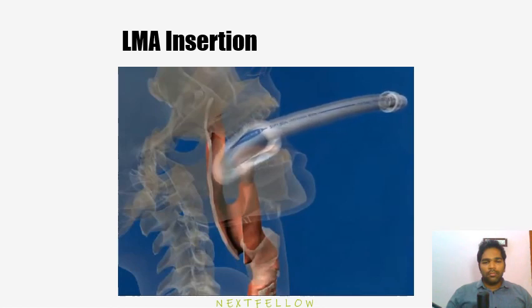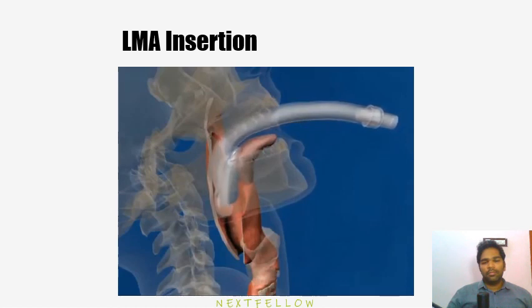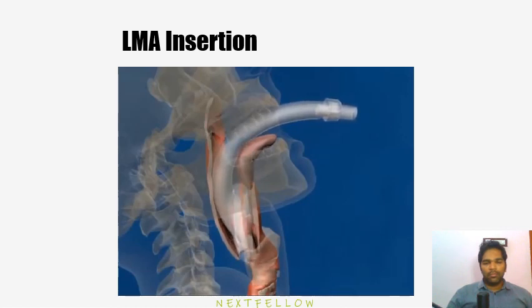tongue and prevent the tongue from entering the atrium of the mask. You can even tilt the LMA slightly to avoid the tongue coming in the way of the LMA. The angle of insertion is maintained as the tube approaches the posterior wall of the pharynx. At this point, the tube naturally rotates to lay flat against the base of the tongue.